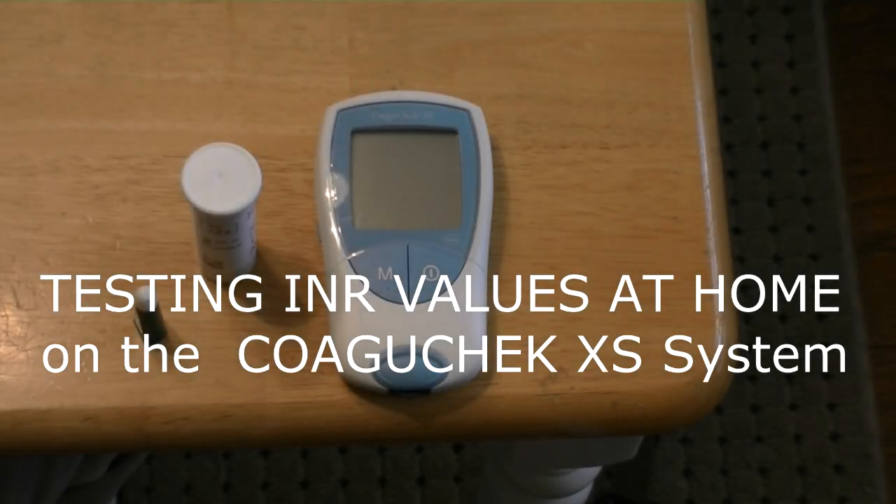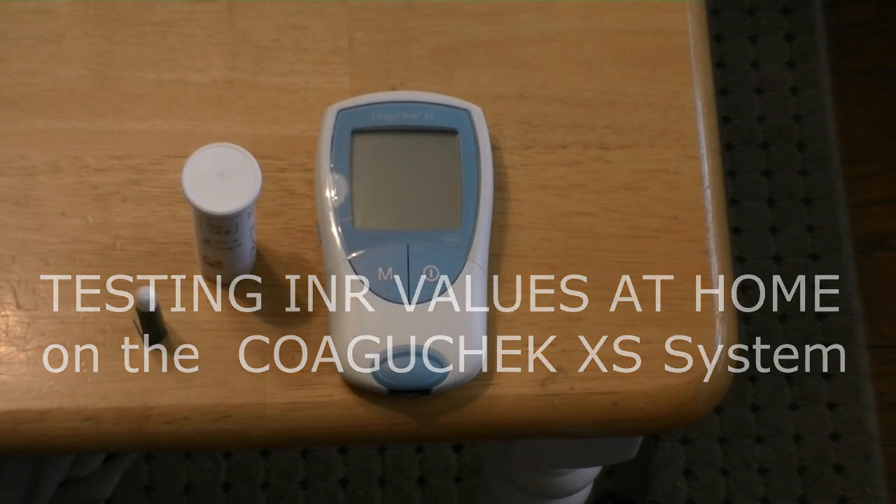All right, we're going to show you today how to do an INR check on the Coaguchek XS machine. We're going to do a series of these so you can figure out what you're doing if you're new to this.